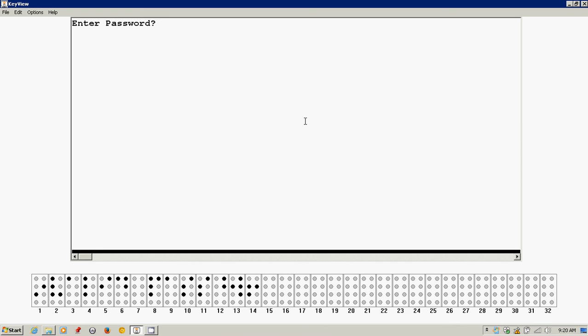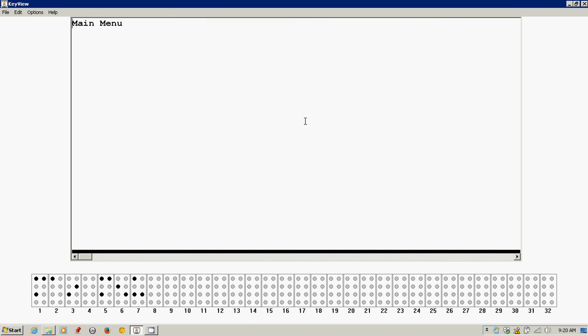So now I'll type in the correct password, T-E-S-T-I-N-G. Exit. Main menu. And now I'm right back at the main menu, just as I was using my APEX normally.